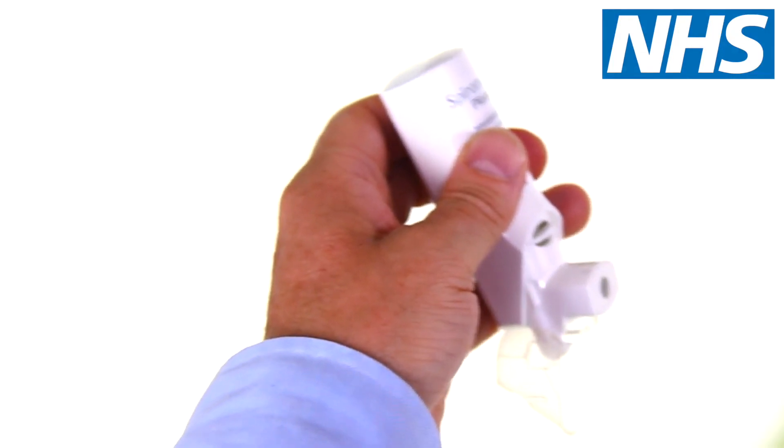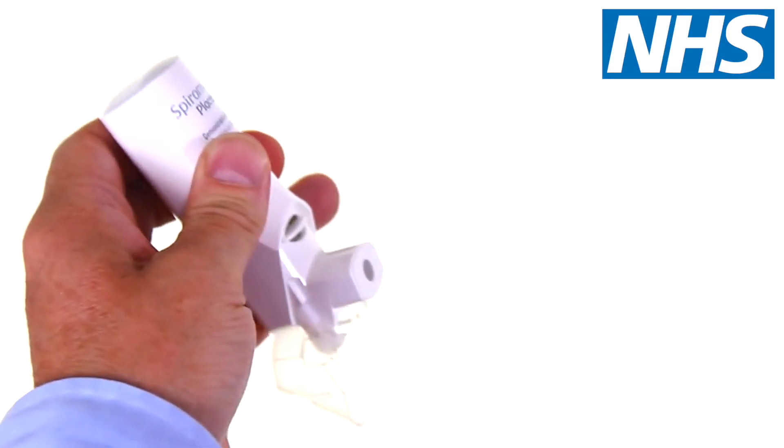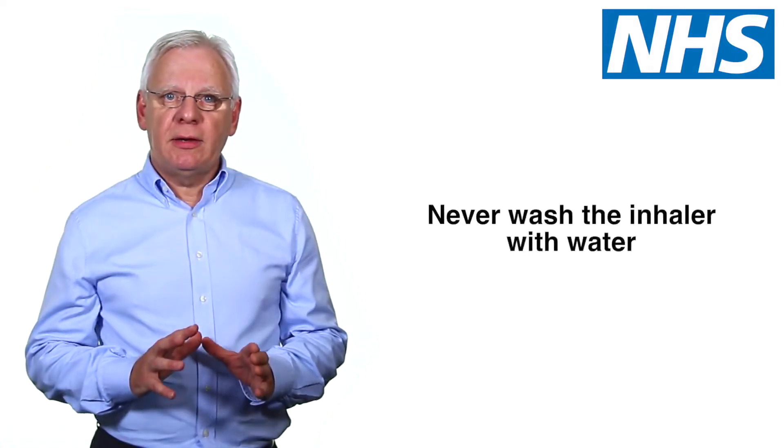To clean your Spiromax inhaler, wipe the mouthpiece inside and outside with a clean, dry, lint-free cloth to remove any powder residue. Never wash the inhaler with water.